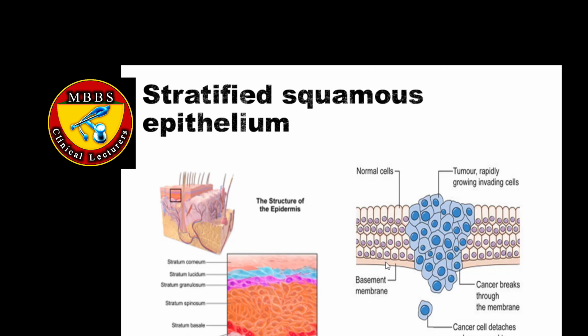That is high-grade dysplasia. If it involves only the lower third, it is mild dysplasia. If it involves the middle two-thirds, it is moderate dysplasia. When it involves all the 3 layers, it is known as high-grade dysplasia or carcinoma in situ. They are interchangeable terms. So for now, you are not seeing carcinoma in situ maybe from here to here, but now look at this area.